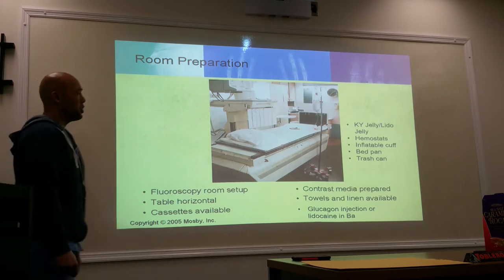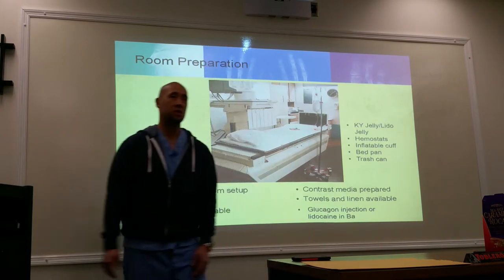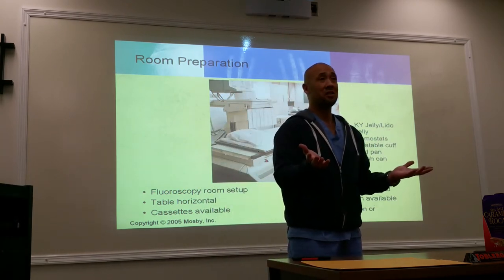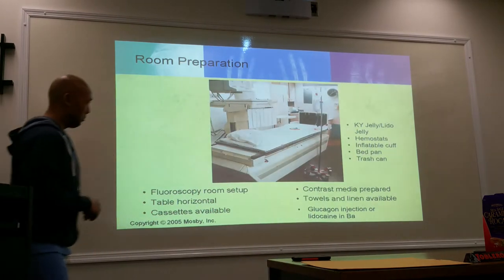And then also what you'll need available are your positioning sponges. So have your positioning sponges ready to go too. You're going to have your patient lie on their belly, on their back, in different oblique positions. They may be standing up. So have your positioning equipment ready to go.